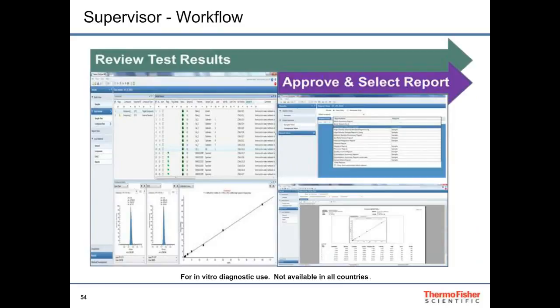ClinQuan MD software presents batch results with status flags to alert the supervisor of any issues with the final results for each injection. Analyte peaks, as well as their respective internal standard peaks, must pass specifications for retention times, areas, symmetry, and ion ratios in order to assure their identities and purities. Calibration plots must pass specifications for regression statistics, precision, and accuracy. QC results must pass specifications for precision and accuracy. And these specifications are defined by the lab director and written into the test method.